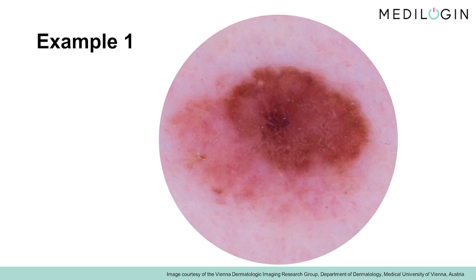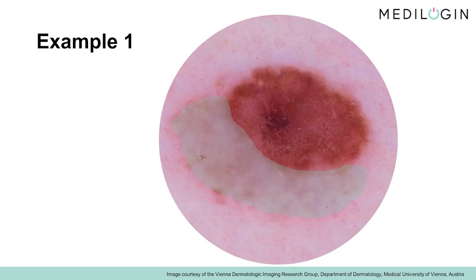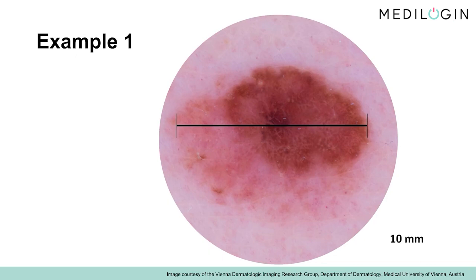Let us start with the first melanoma, and judge it using the interpretation algorithm. At first glance, one recognizes an asymmetry of both geometry and coloring. The lesion is peripherally poorly defined. You'll recognize two different colors, these are asymmetrically distributed. The diameter is approximately 10 mm. The ABCD rule alone suggests the diagnosis of melanoma.